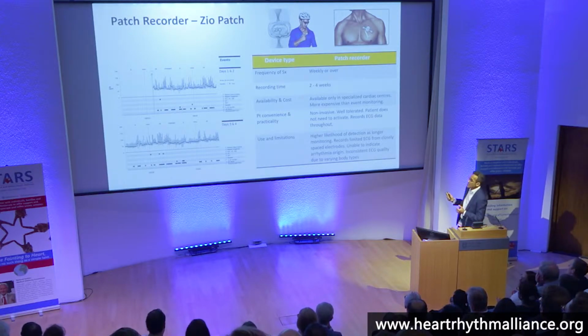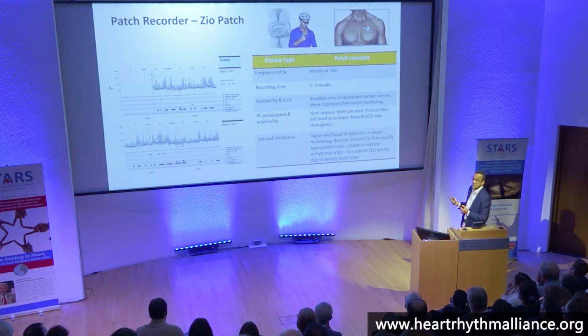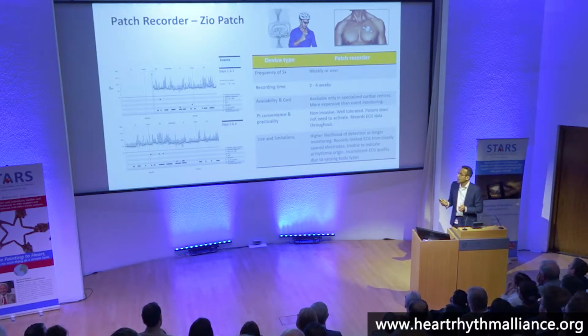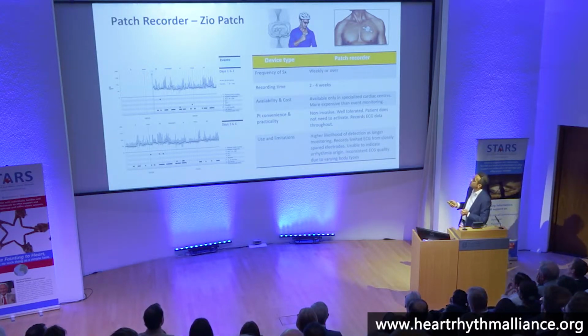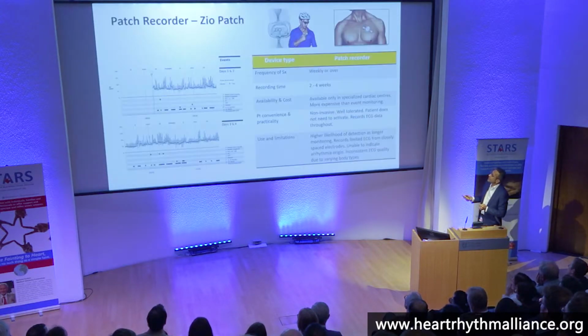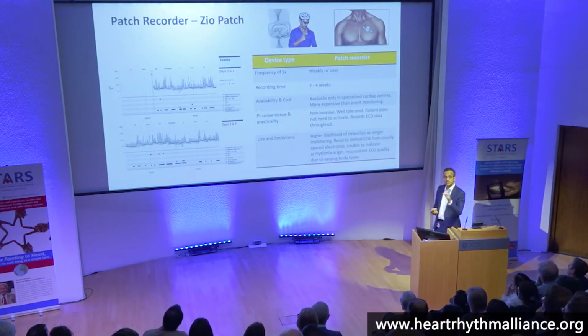They're disposable, they're waterproof, they can be worn at all times, and they stick for a whole 2 weeks, up to 4 weeks as well. They do not necessarily require patient interaction, but you can document episodes. This is what the disclosure looks like. I'll just go back one. Because the spacing between the electrodes is quite narrow, you don't always get the ECG resolution you want.